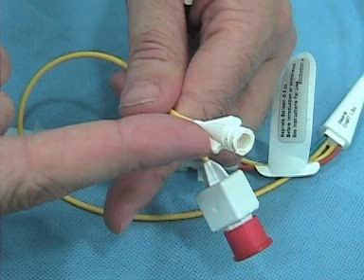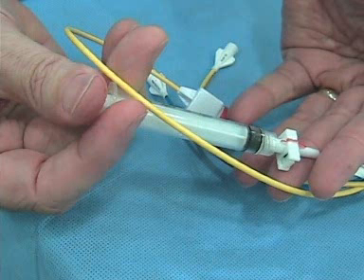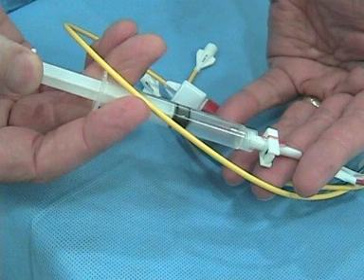When you're the tech who has to hook all this up, there are all different kinds of hubs — make sure the yellow is hooked up to the distal and the blue is hooked up to the CVP. It's worth working with one of these a few times, because there will come a day when you're on call and have to be the tech — they're not always there, particularly in the middle of the night. When you inflate the balloon, make sure you use the provided syringe; it's only got one and a half cc's of air. You don't want to over-inflate the balloon.